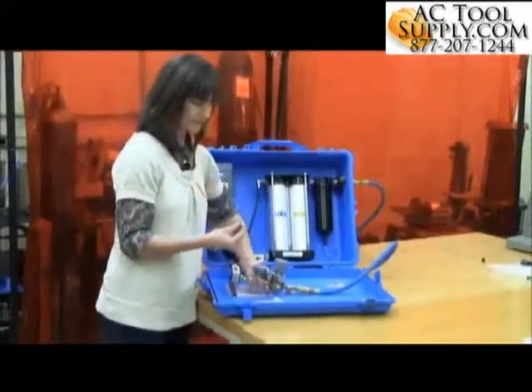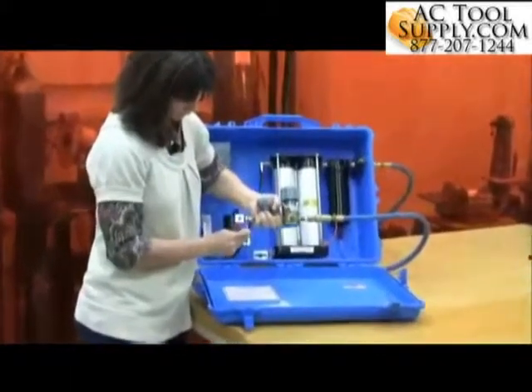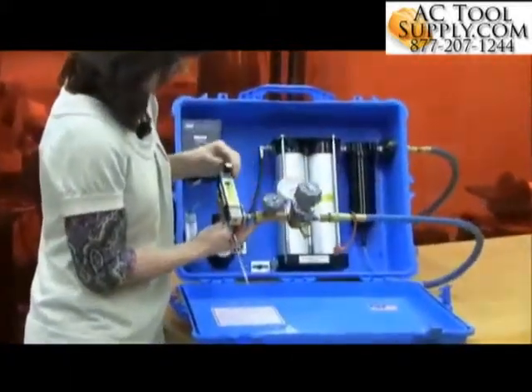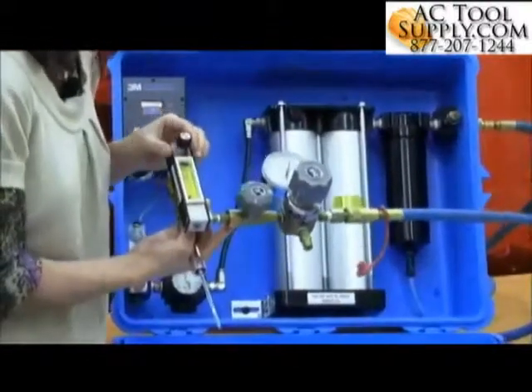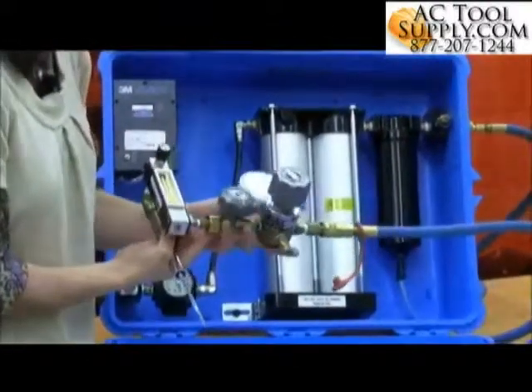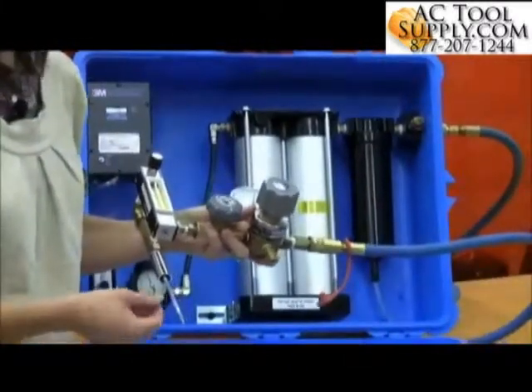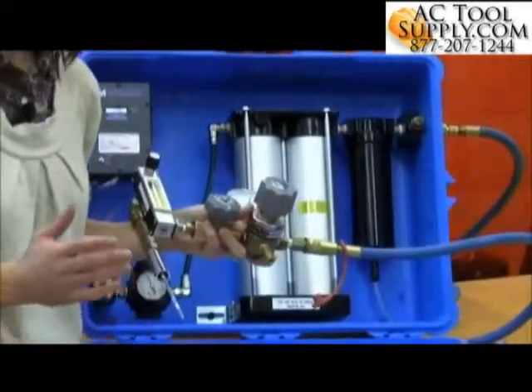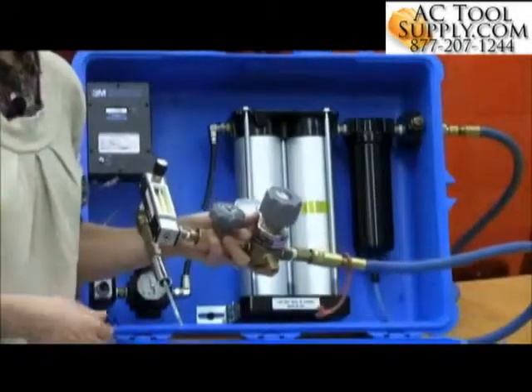Take the tube and connect it, then adjust the airflow to make sure you've got the proper air going to the tube. You'll want to check the instructions that come with each tube, because the testing time for each tube is going to be different — it ranges from about 30 seconds up to maybe 30 minutes depending on the tube.